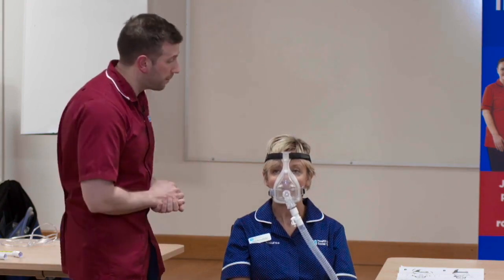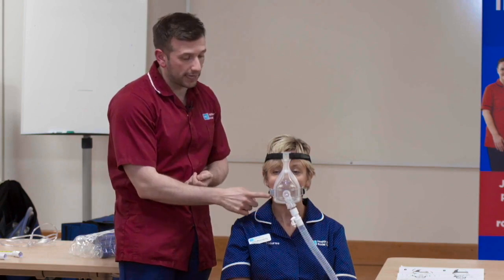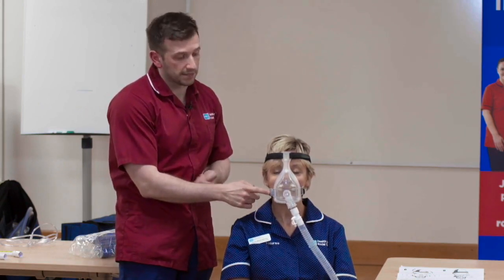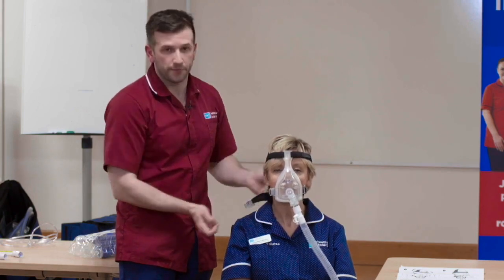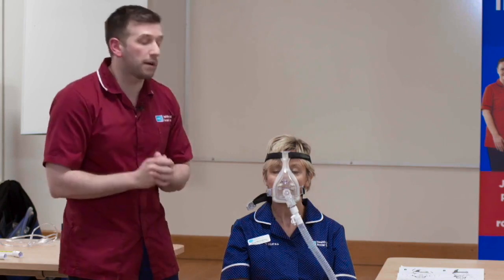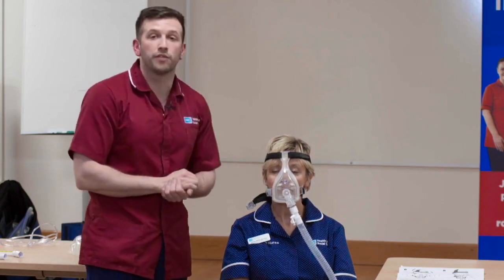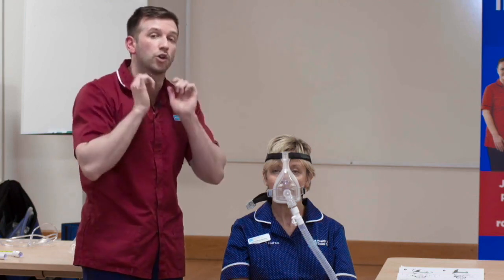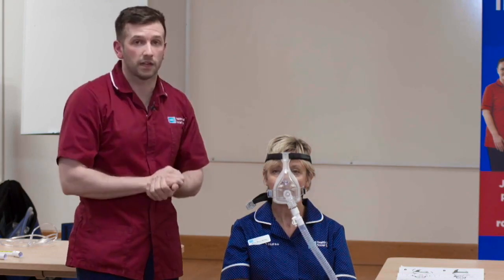We would encourage our patients to try to locate the buckle located on the side of the mask, to push the button in to release the mask like so. We also reassure the patient that there are Velcro straps, and if they were unable to remove the mask without healthcare staff present, that they can try to locate the Velcro and remove the mask themselves.